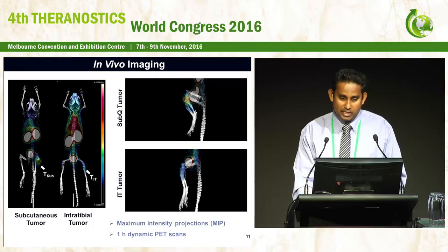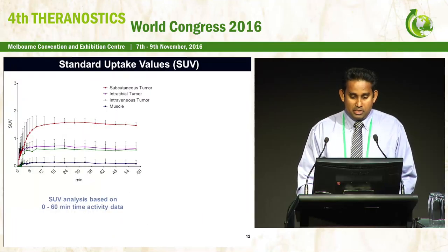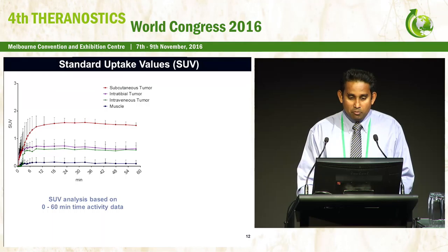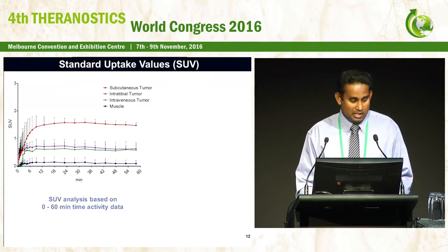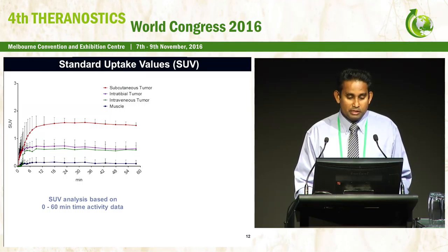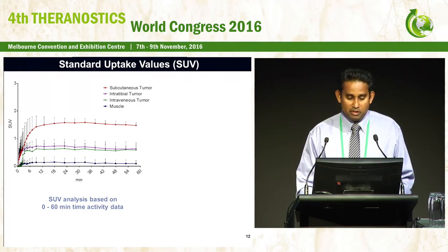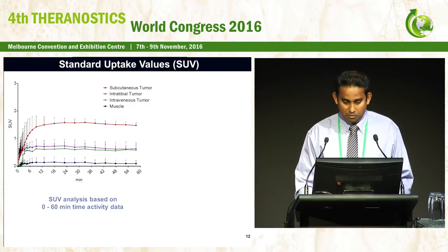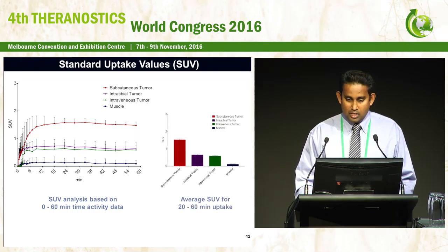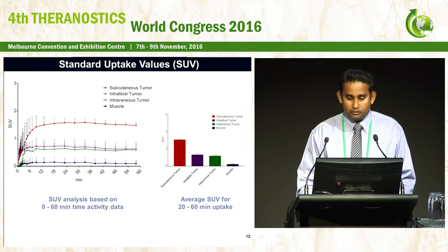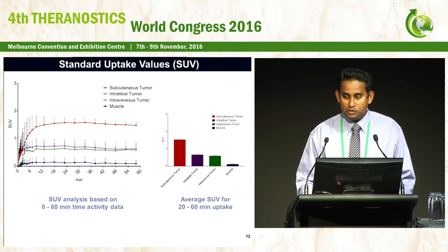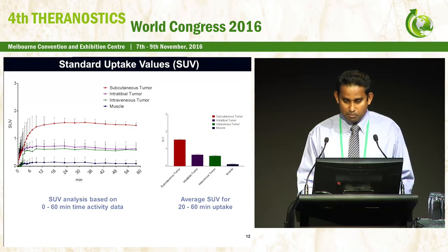Using these PET images, we have summarized them into time-activity data. Here, I am comparing the three tumor models with muscle. Over time, you can see the tumor cells accumulate gallium and saturate very quickly. Taking the linear portion of the saturation curve, I have produced this bar chart so you can compare the quantitative values of each tumor model side by side.